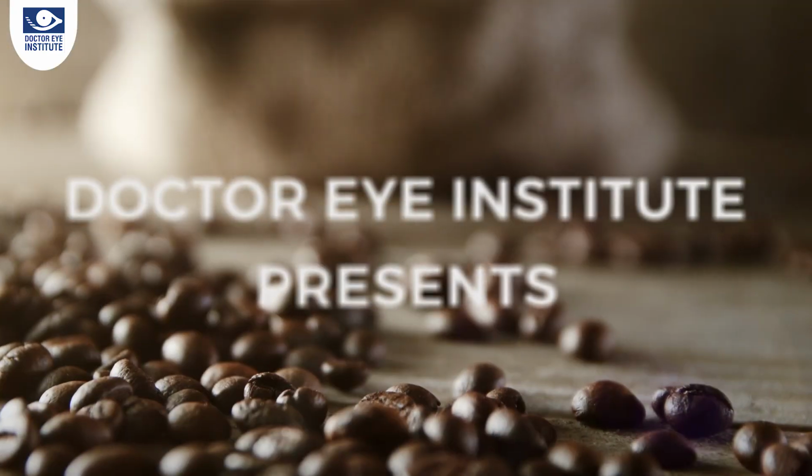So in my past episodes, I've described several times that it can be said that cataract surgery is actually a lens replacement surgery. So we have to remove the natural lens from the human eye and then replace it by an artificial lens, and that's called the implant or the IOL. Sounds interesting, isn't it? So let's dive into this topic right away.